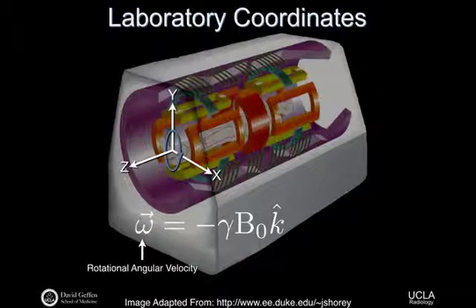B1 is going to force it to move in a clockwise manner. B0 is going to do the same. That's just the physics of the problem. If your gamma was negative, and that's possible, some spin isotopes have a negative gyromagnetic ratio, then they're going to be precessing with the opposite handedness. And I'm sure that screws people up if you work in that field.